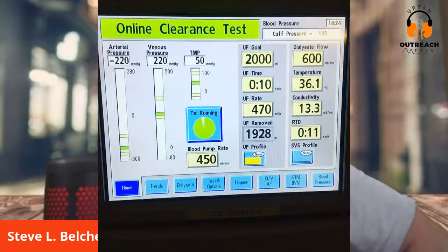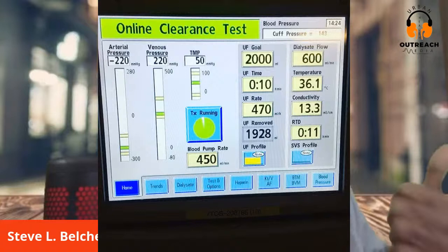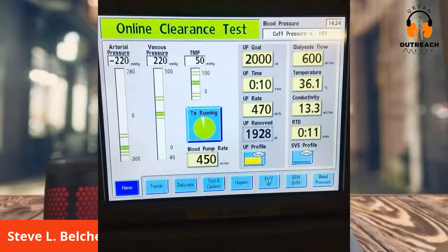When you see UF time, right now that person has 10 minutes left. That's where you program the treatment time, whether the person is 4 hours, 4.5 hours, 3 hours, 3 hours and 45 minutes, or 3 hours and 30 minutes. That's where the UF time goes. When the machine starts to run, and you look all the way down to the right where it says RTD 11, technically those two numbers, the 10 and 11, are supposed to match up.